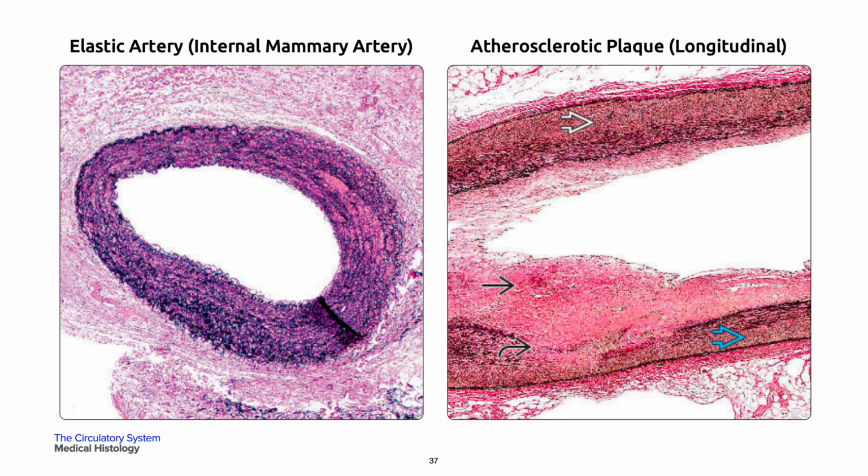On your right is an artery containing an atherosclerotic plaque. This is in a single black arrow. Note the dissolution of the internal elastic lamina (curved black arrow) and the atrophy of the media underlying the plaque (bold blue arrow). This is compared to the medial thickness opposite (bold white arrow).